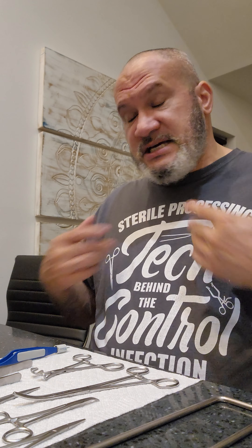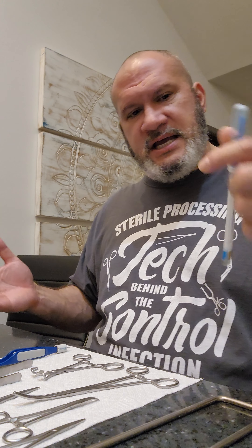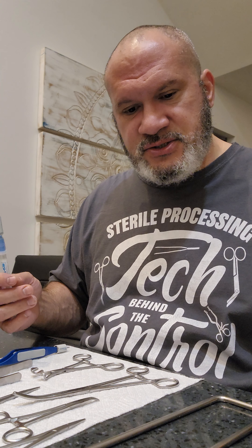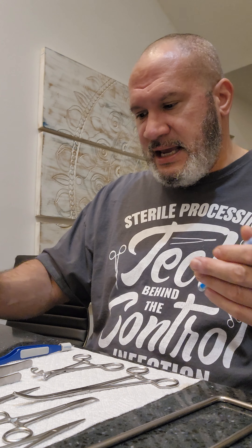Cleaning verification is, in my opinion, done during the assembly process. You do your general inspection and everything looks very clean — everything passes inspection, everything is generally clean — but you want to go ahead and grab a cleaning verification tool. Depending on which tool you use, this is a specific marker for a specific type of soil. Your policies and procedures come in here: what are you actually testing for? When doing cleaning verification, you should be pairing your instruments off into types.